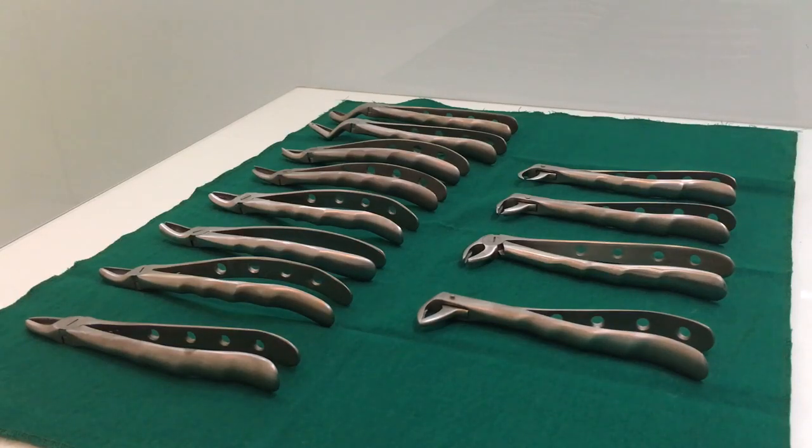Hello everyone, this is Dr. Ayushi and today I am going to show you how to identify different dental extraction forceps.